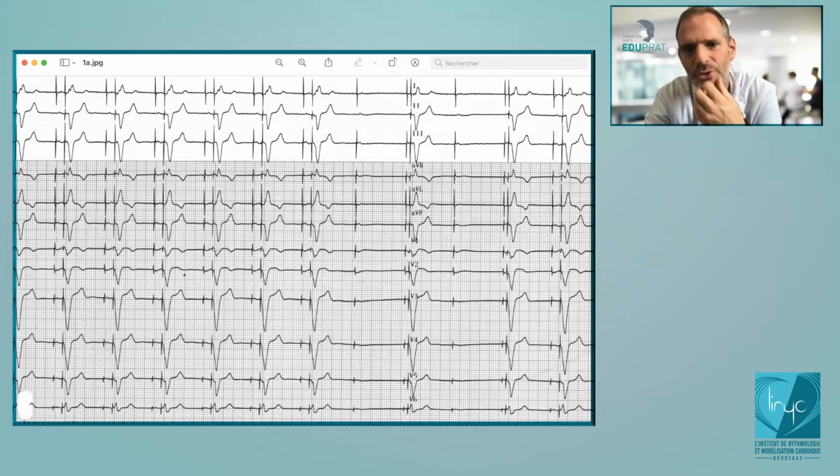One of the limitations was that you could have some ventricular pause, more or less double the minimal heart rate. If you are programmed to 60 beats per minute, you could have a ventricular pause of around 2 seconds. And I will show you on a tracing that that can be a problem. And there was no consideration of the PR interval.